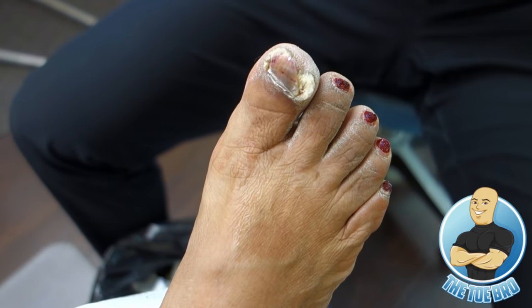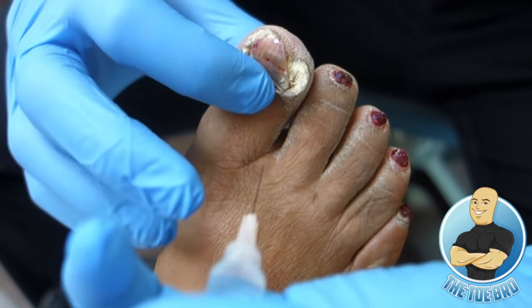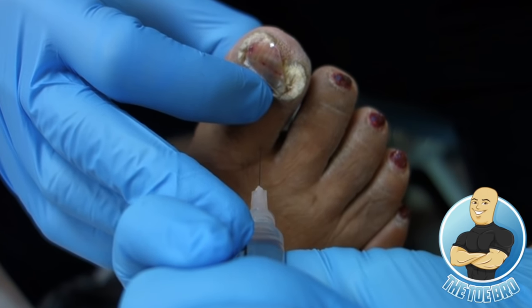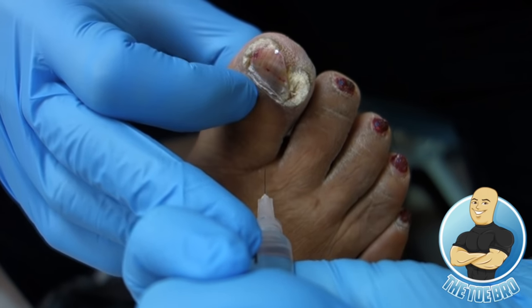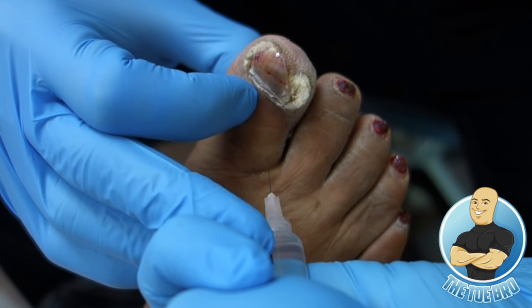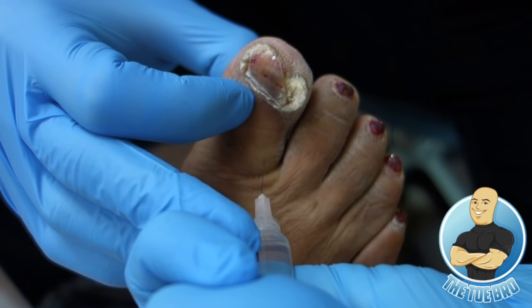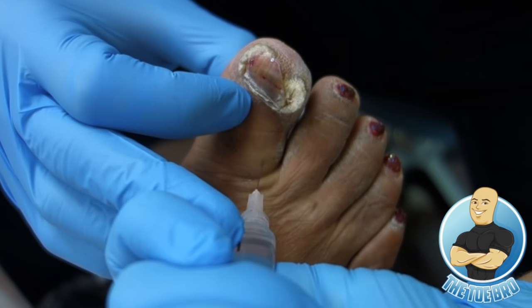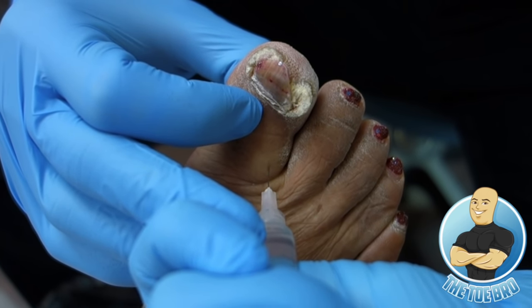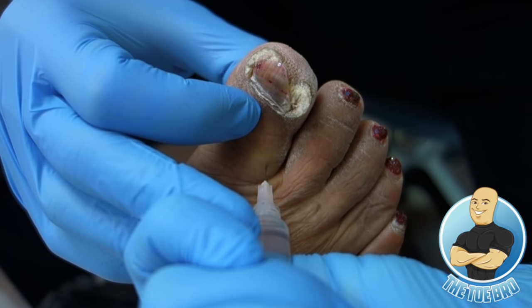So what we have is a triple whammy, a triple threat. We have a thick damaged toenail, we have a fungal toenail, and then we also have warts that are growing underneath the toenail and to the side. So this was a very complicated case. We went through all the options on how to treat the warts, how to treat the thickened nail and the fungal nail. And what we decided to do was to take care of all three problems with one procedure.